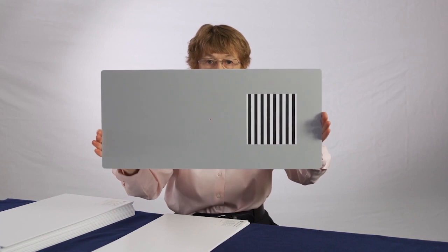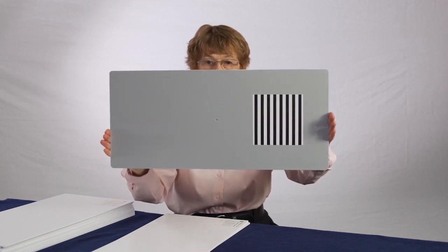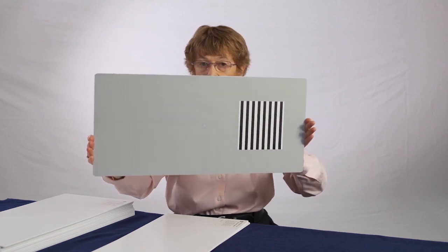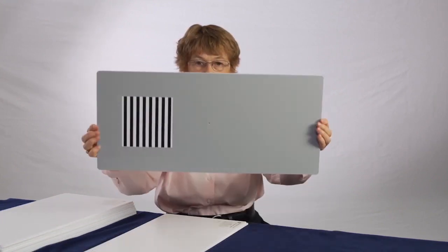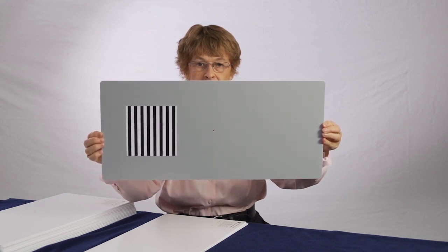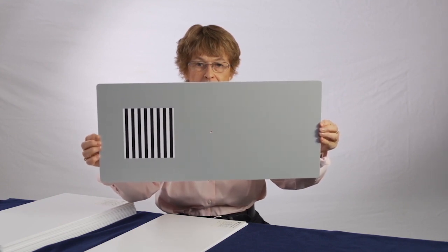The card is shown to the patient by an examiner holding it along the edges. They should not be touching the front surface of the card. If the examiner uses fingers to hold the card, rather than the palm of the hand, fingertips should not touch the front except possibly within 1 inch of the edge of the card.